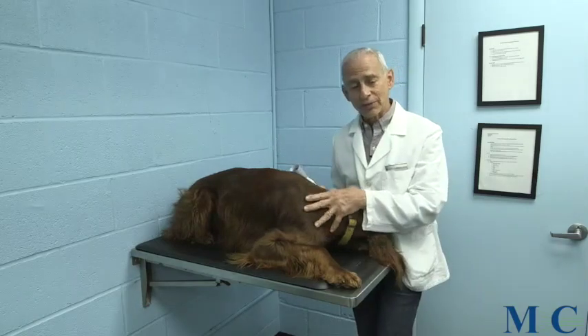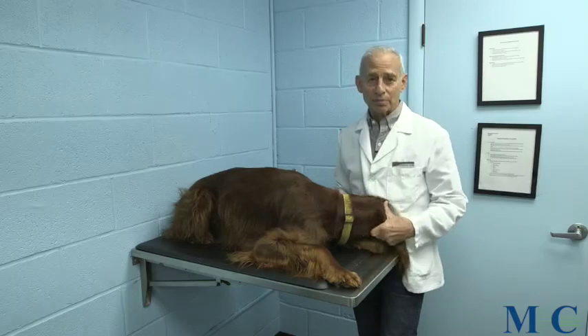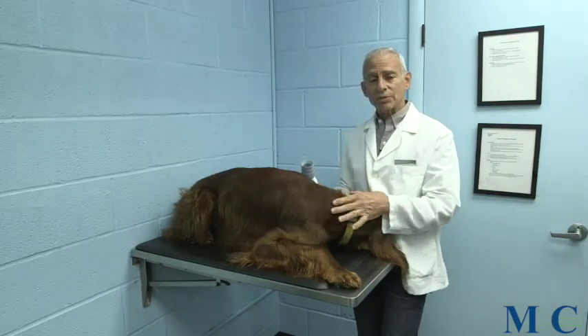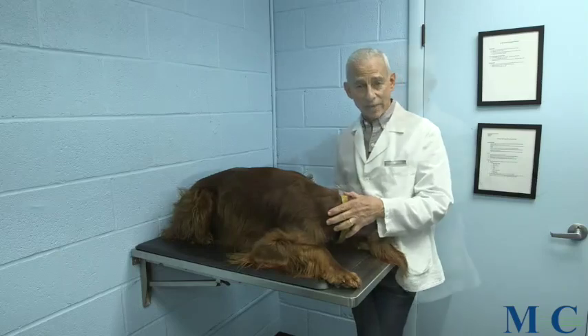Any time that we're treating for any type of condition, there is a several-prong approach. That multi-prong approach involves not just treating the target tissue, but also involves treating for circulation — so when we do that we treat the lymphatic area.